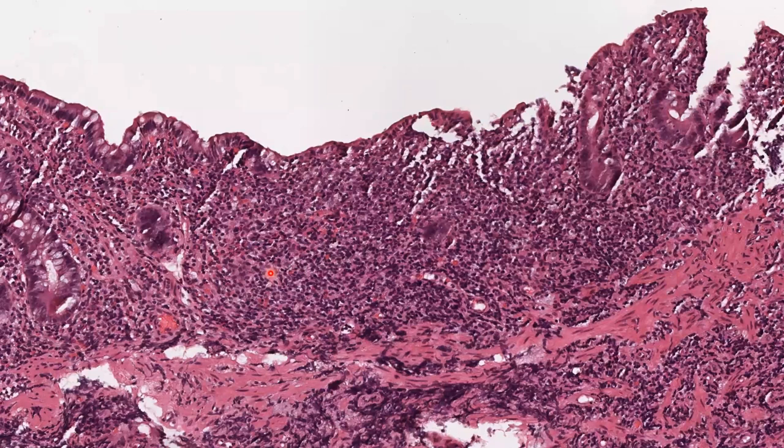If I tell you there is a crypt atrophy here, you will say yes, right? A lot of you say yes, of course. But again, can you rely on this as a feature for ulcerative colitis or inflammatory bowel disease? No, because a lot of the pouchitis, as I have shown you in the histological features, can also have this atrophy. So it is not going to be utilized as a feature.